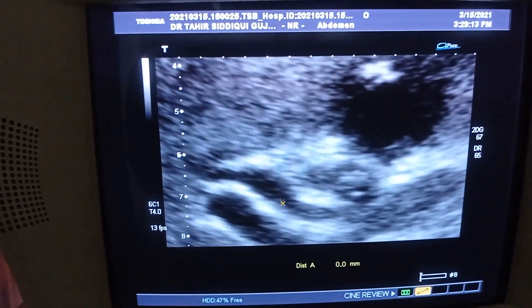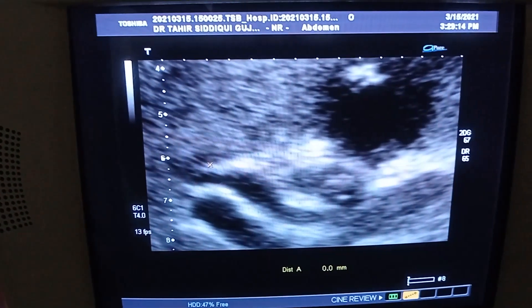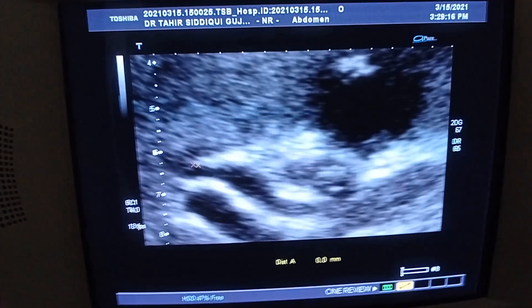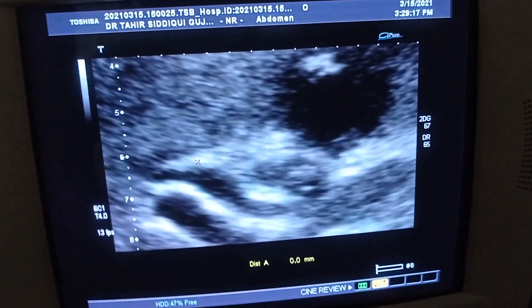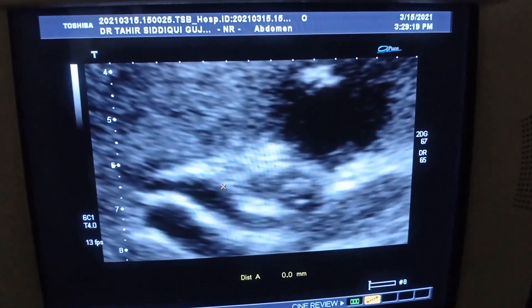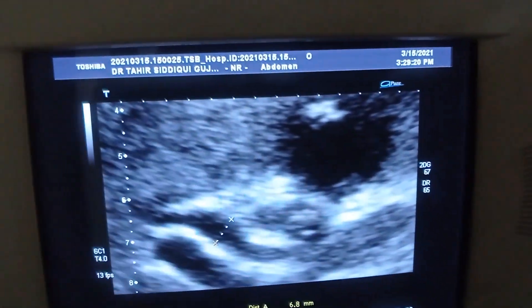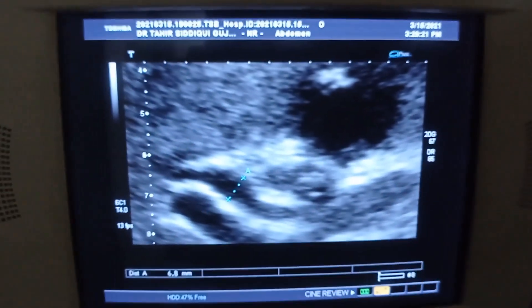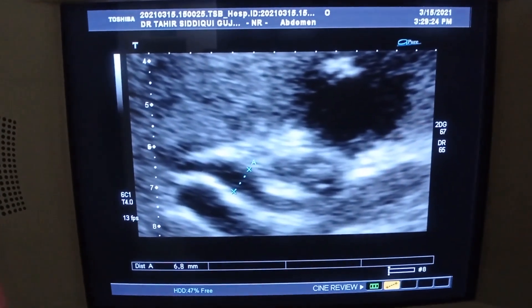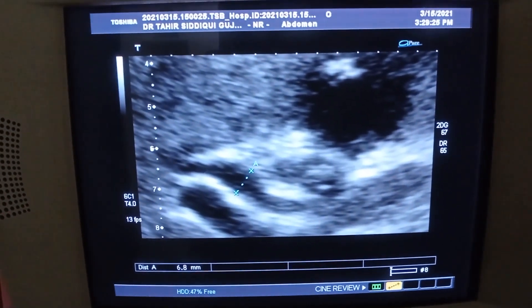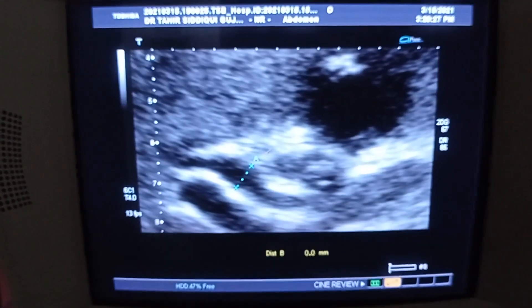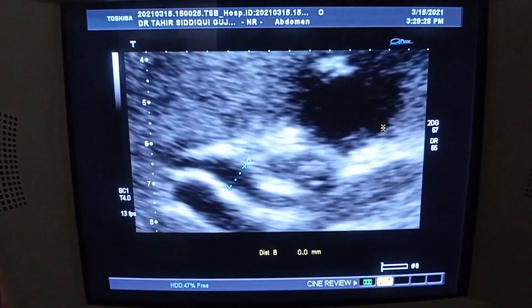This is the common bile duct, which is running anterior to the portal vein, and it measures approximately 6.8 millimeters. Normally it is up to 7 millimeters, so this is within normal limits at 6.8 millimeters. This is the gallbladder.